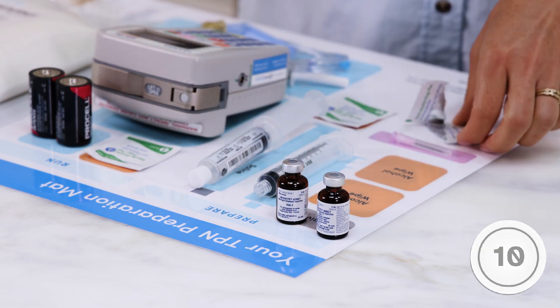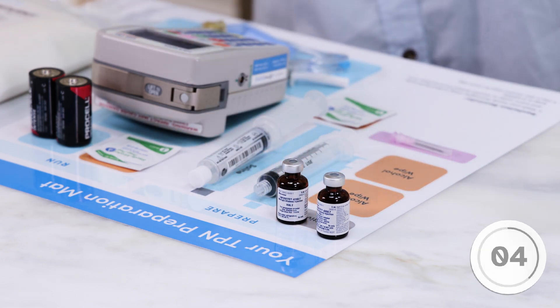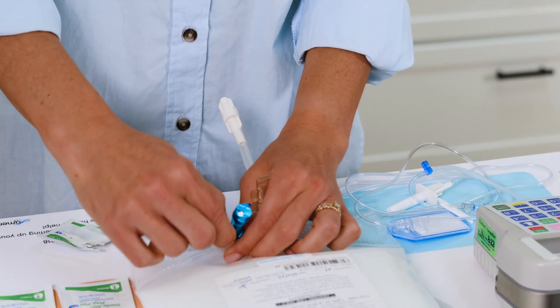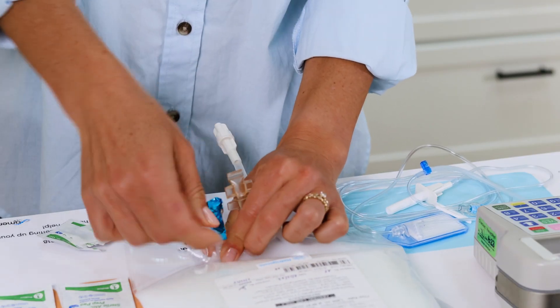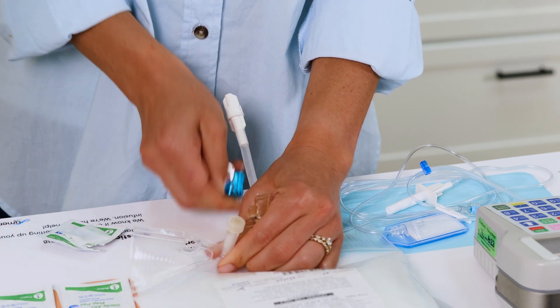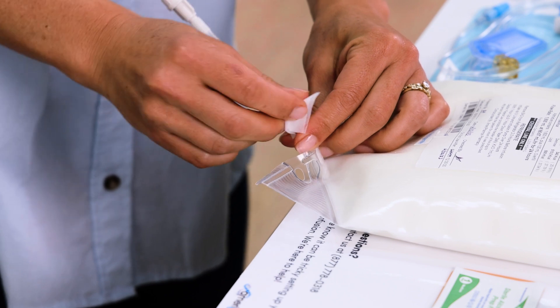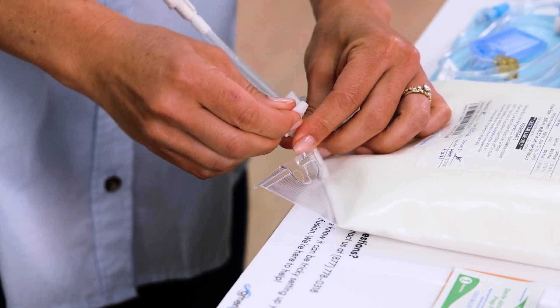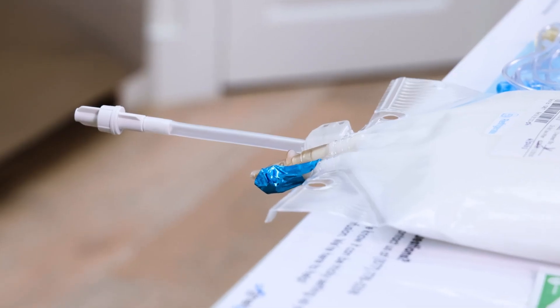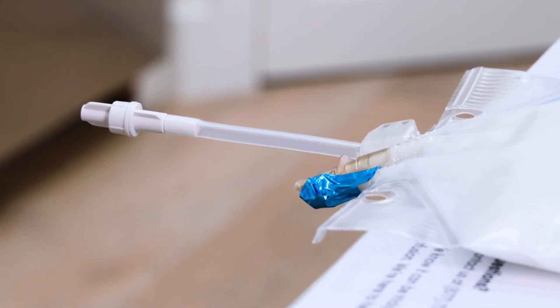Allow the vials to air dry for 10 seconds. Remove the seal from the injection port of the TPN bag and with a new alcohol pad clean the injection port. Make sure you don't touch it with your fingers or let it touch any surface after it's cleaned. Make sure the ports of the bag hang off the table when placing it onto your work surface.